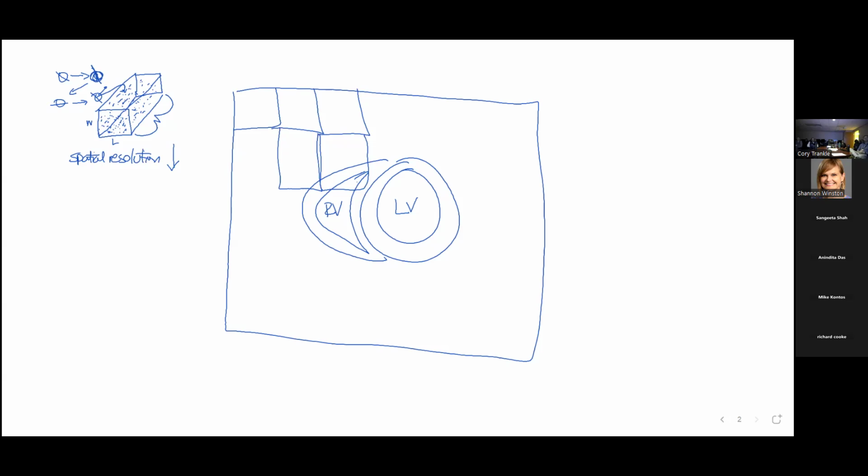If we increase the spatial resolution, what does that do? That means we have little tiny voxels. And look how many protons are in there. Not very many. So when we do the whole thing with the FM radio wave and all that kind of stuff, the problem is we don't have very much signal. But for this, it's great.